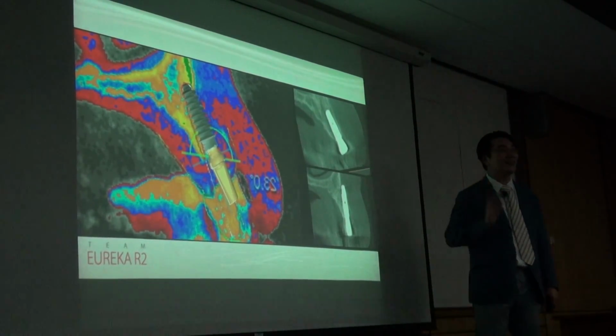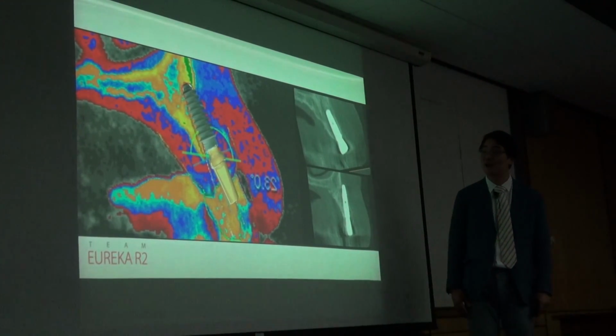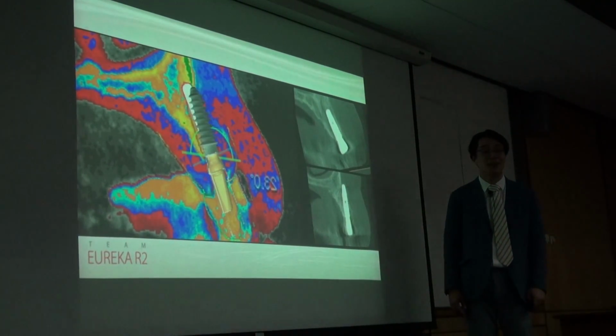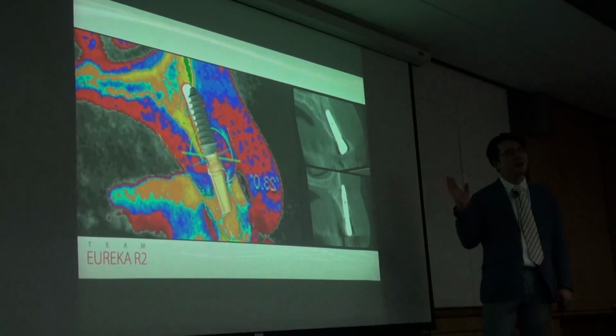It's an illusion. It's a misunderstanding. The real situation is this: the hard palatal bone pushes out the implant and slips like this. It's very important.